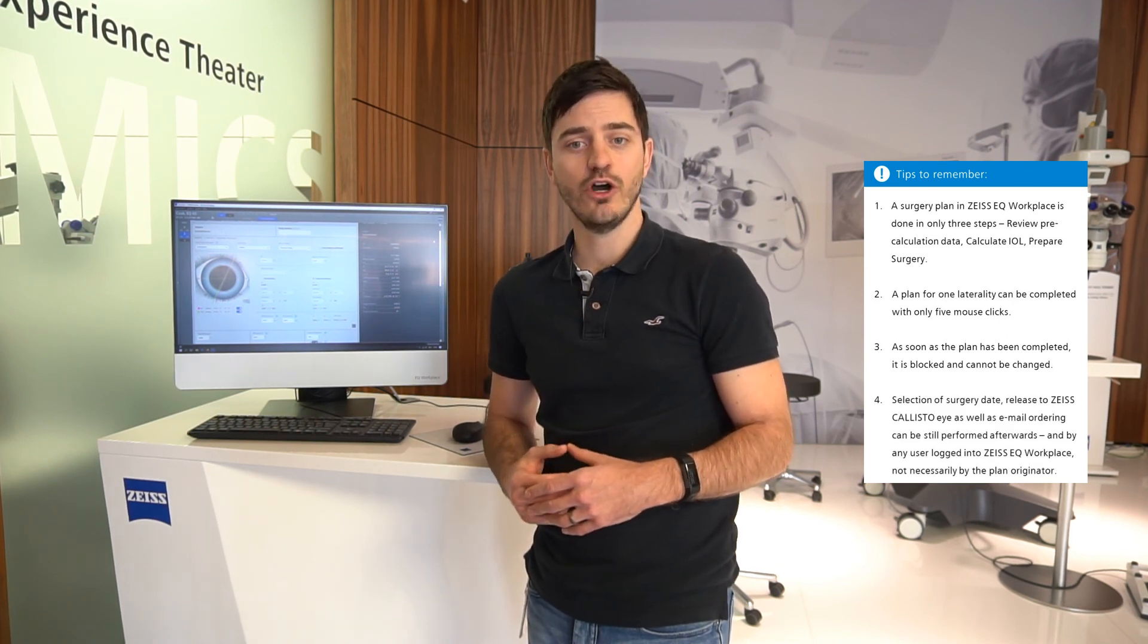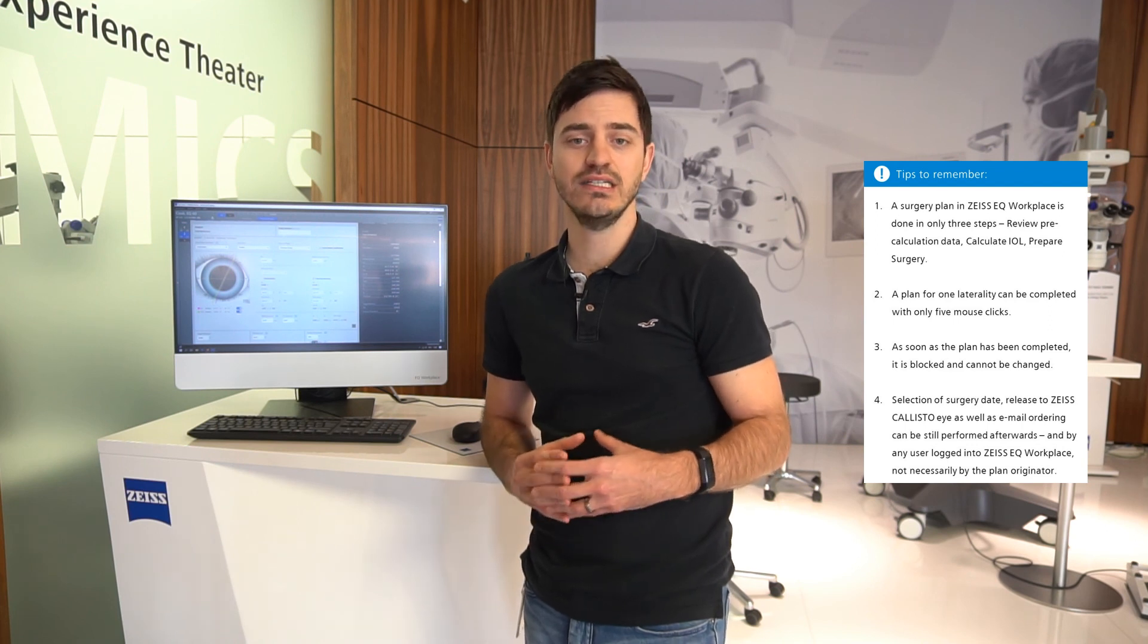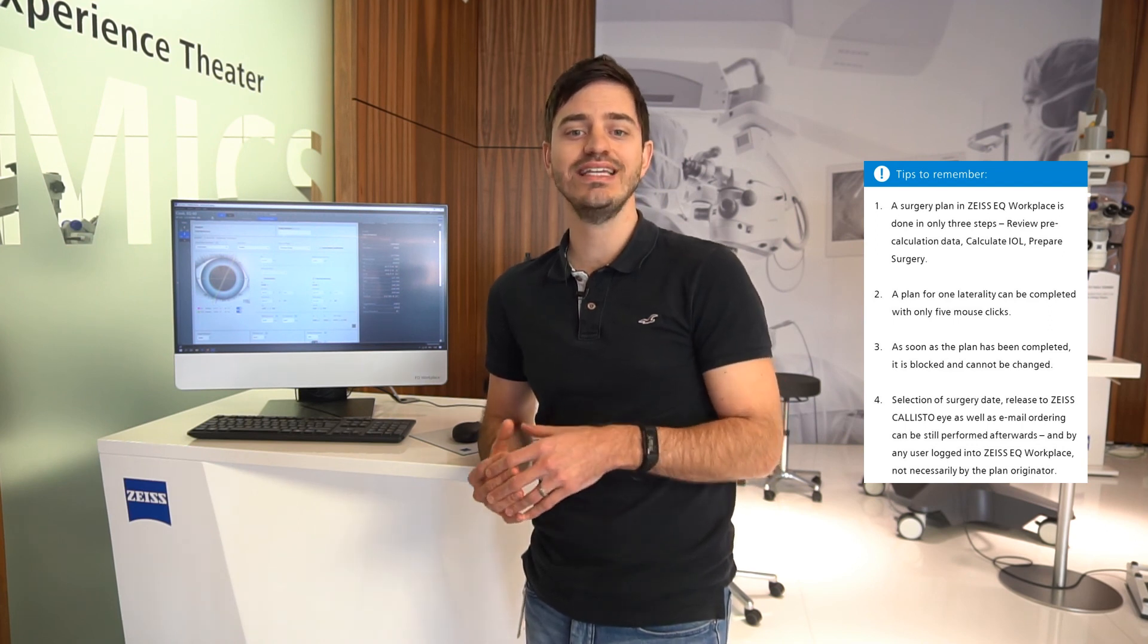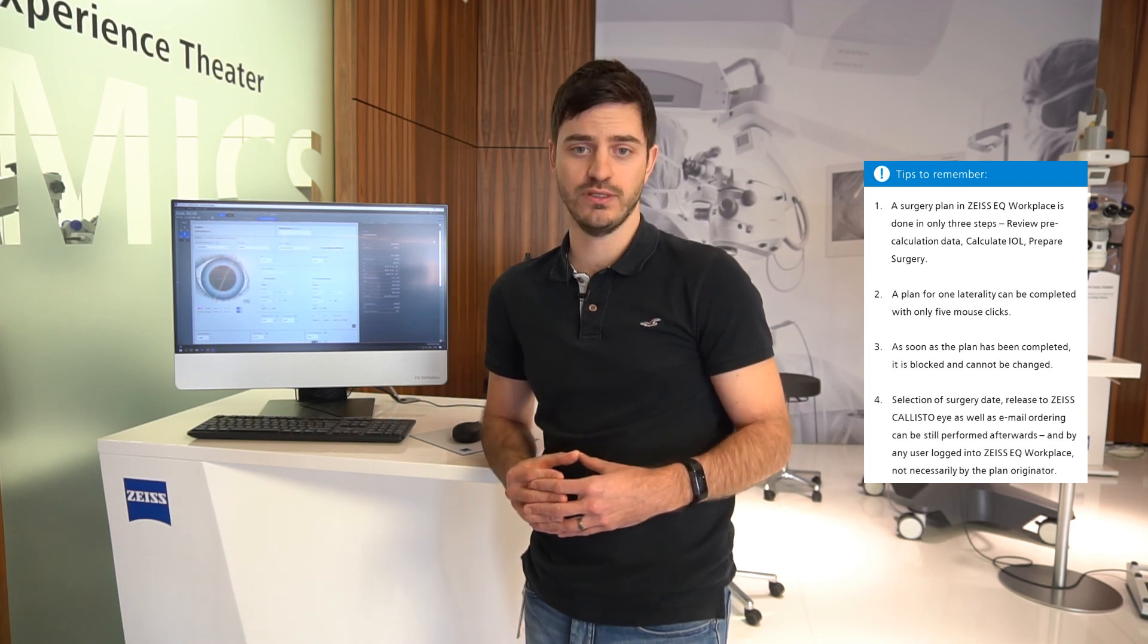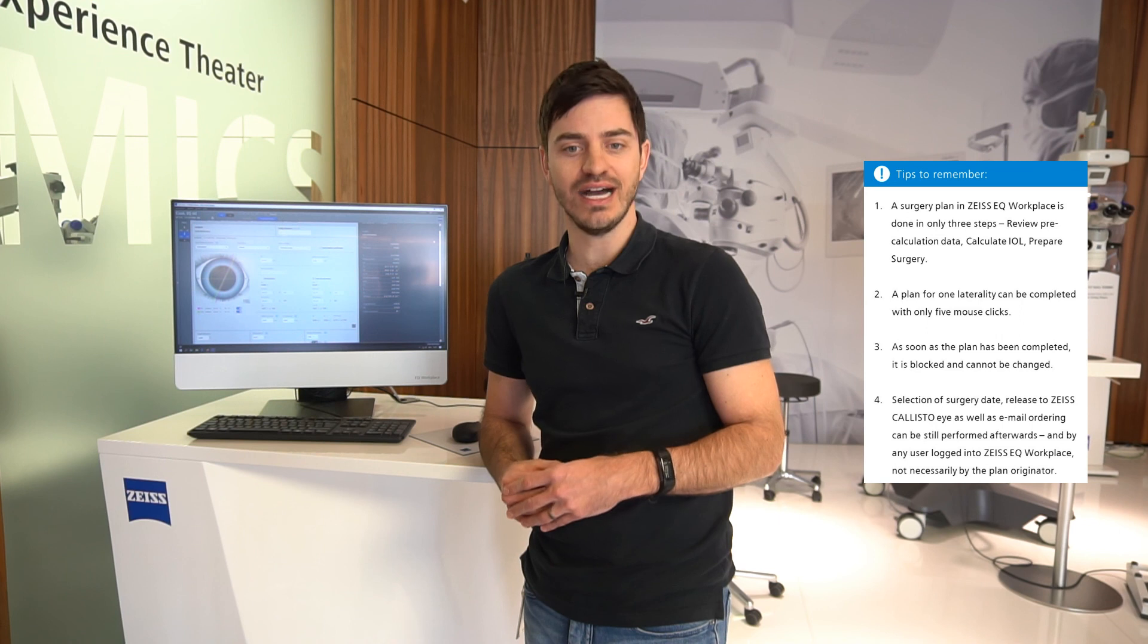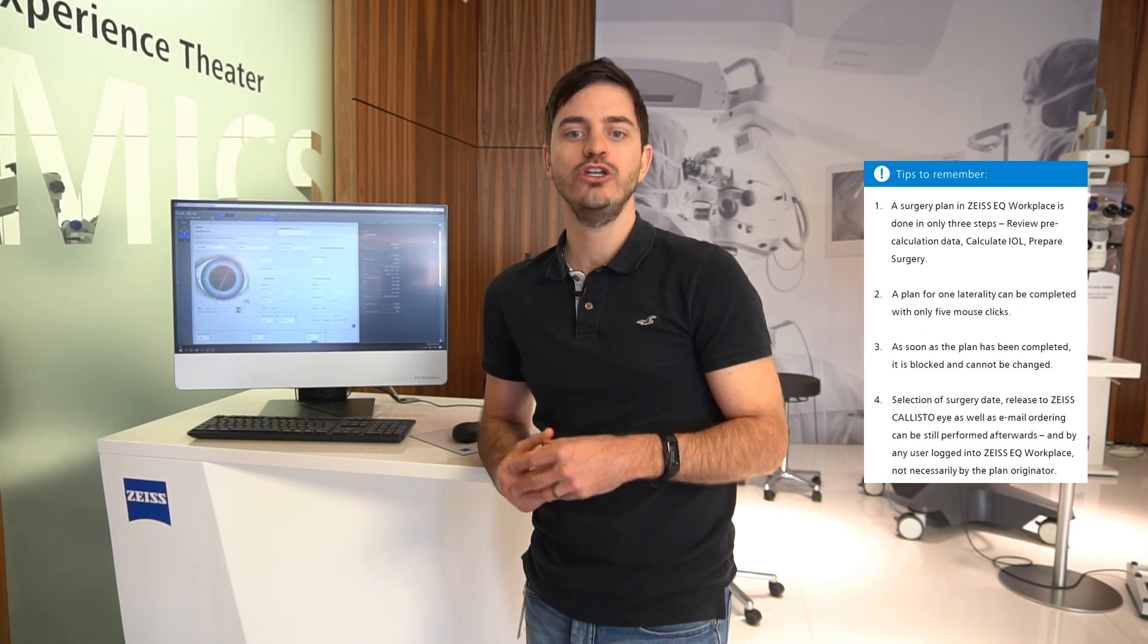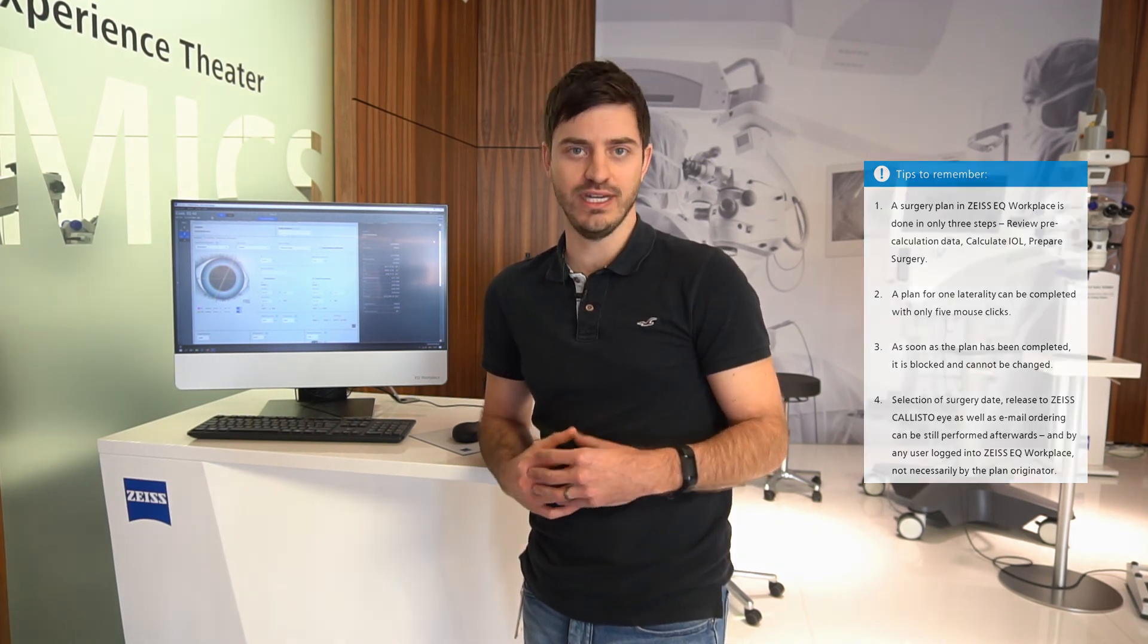4. Selection of surgery date released to Zeiss Callisto Eye as well as email ordering can still be performed afterwards and by any user logged into Zeiss EQ Workplace, not necessarily by the plan originator.